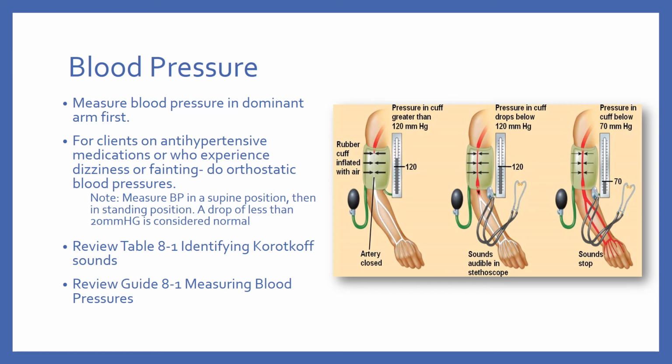To measure your client's blood pressure, assemble your equipment. You want the sphygmomanometer, the stethoscope, a pen, and recording sheet. Assist the client into a comfortable position with their legs uncrossed. The room should be quiet.